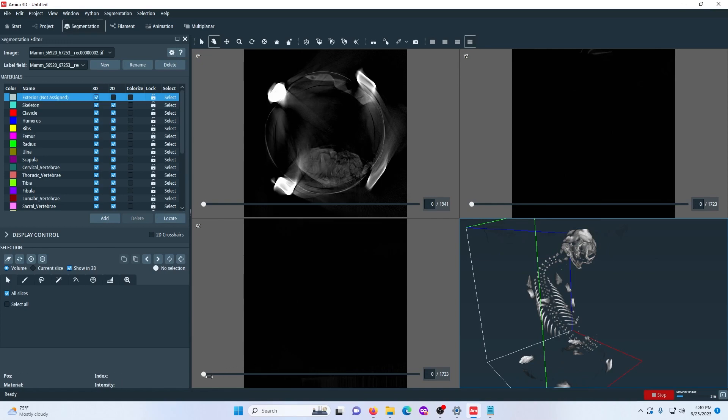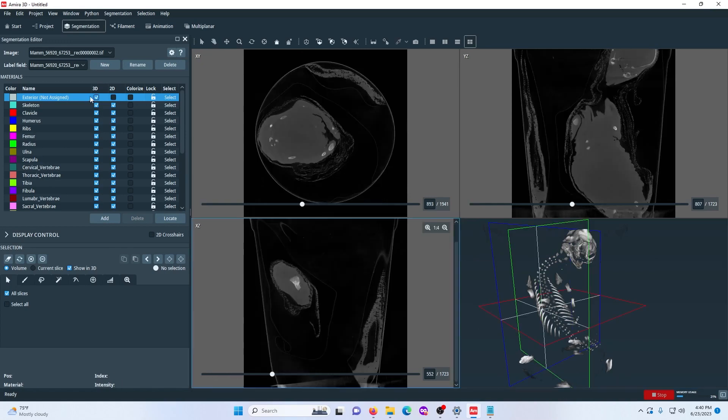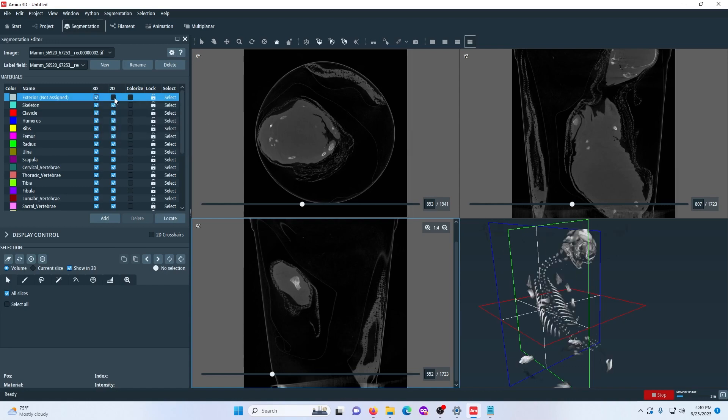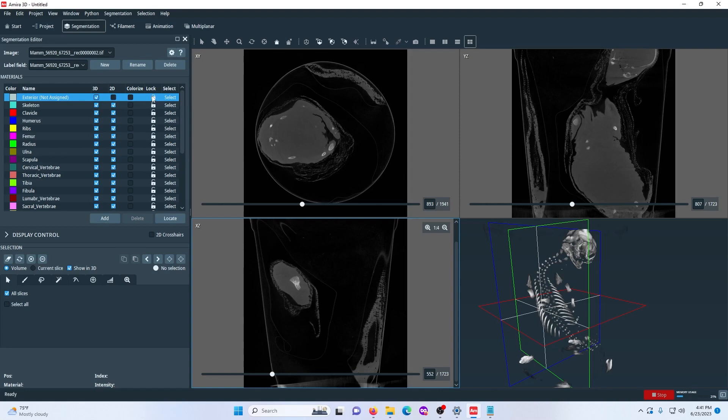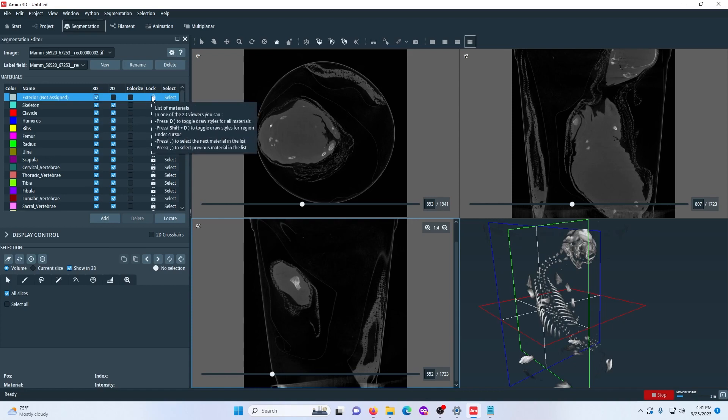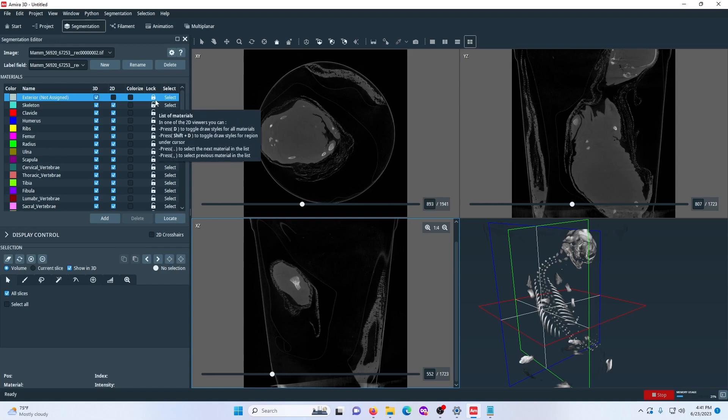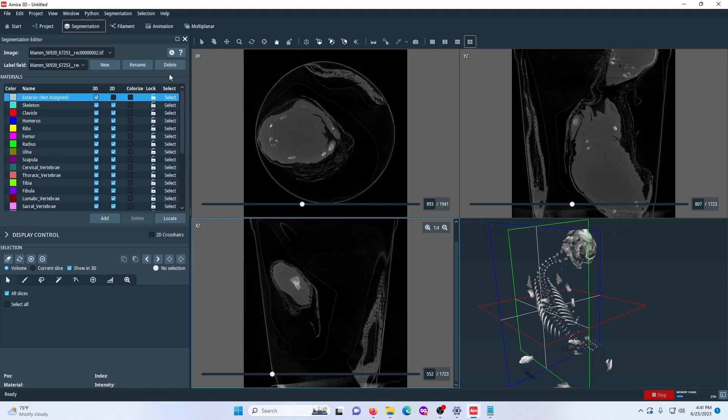Although it's pretty laggy. So I don't know if I would do that. There you go. So it just brings the camera to where you can find it. I'll go into this more in the future, but 3D checking that enables you to see it in 3D and then 2D will show the labels or the border around each material in 2D. Lock, this is a very important tool that I'll explain more later. But it stops the material from being changed at all. So if you lock a material, nothing can be taken or added from it. And finally, select just selects everything in the material so you can add it to another layer or something else. So another thing I would do here is mess with the contrast in 2D.